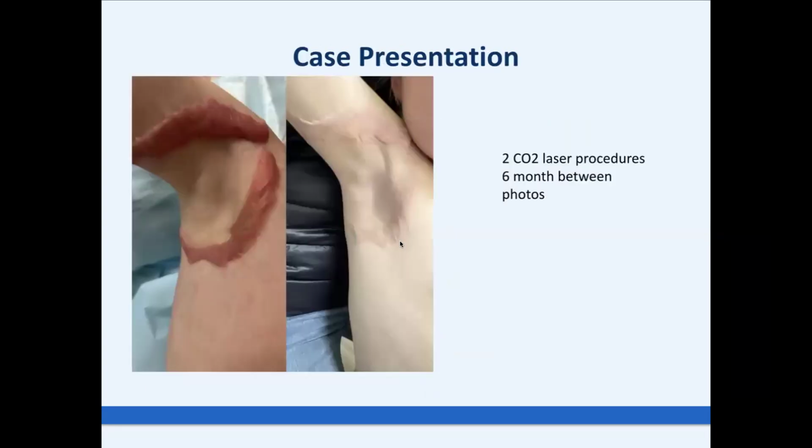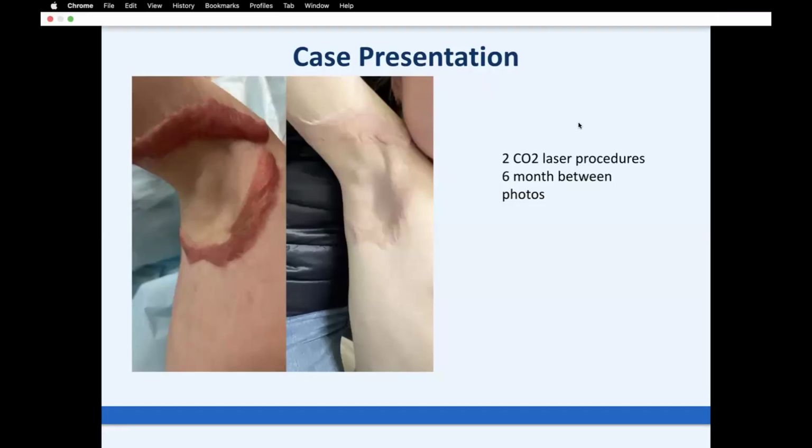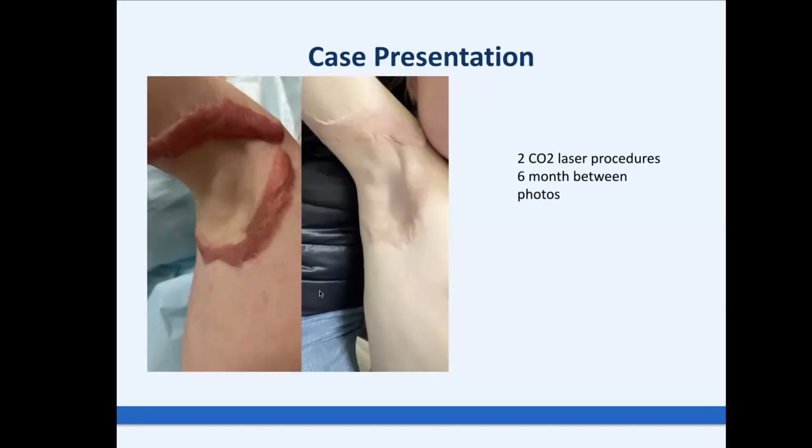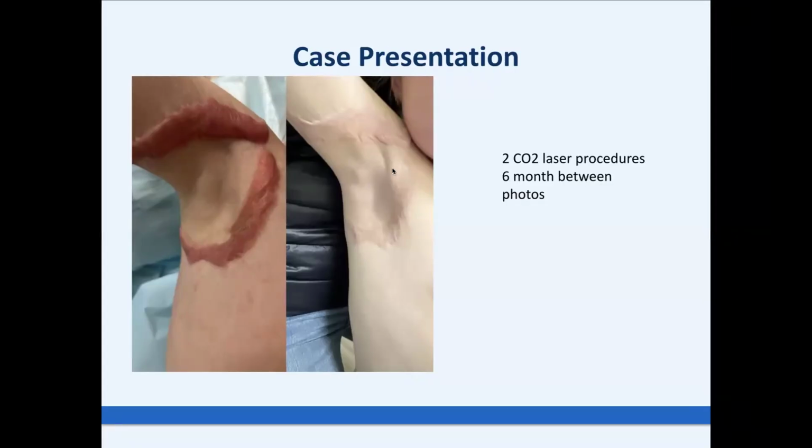So we will begin with our results, and I think these slides are very important, because only when we can see results before and after can we understand that it works. The first patient is a child, a very beautiful girl. She is blonde, and we know that with a patient with blonde hair, not dark, there is more risk of scars, especially hypertrophic scars or keloids.